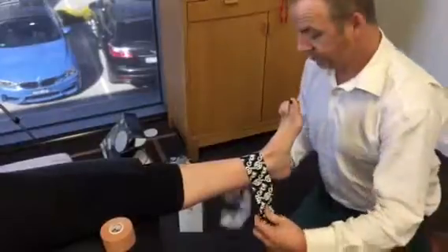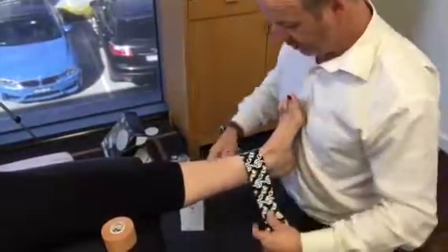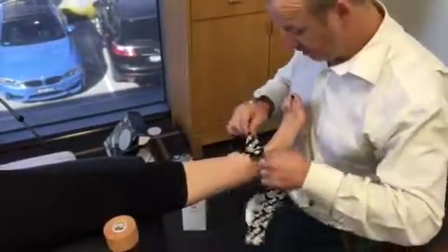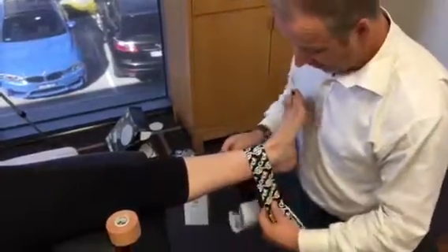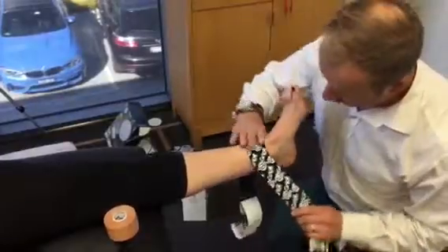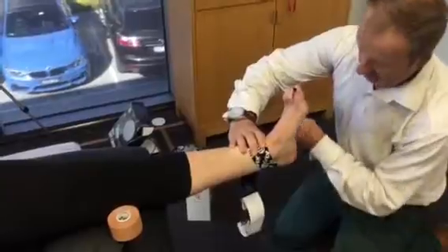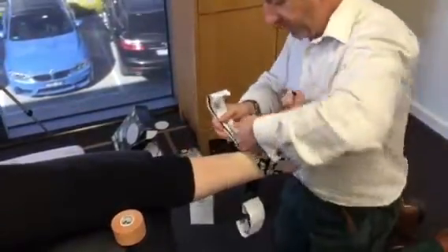We get this tape in the middle and we're going to move it across this way a bit. We want to leverage off this point here. We put a fair bit of pull — a bit of tension on the tape — and then we come around almost like a heel lock, and we come back up to the top of the ankle.